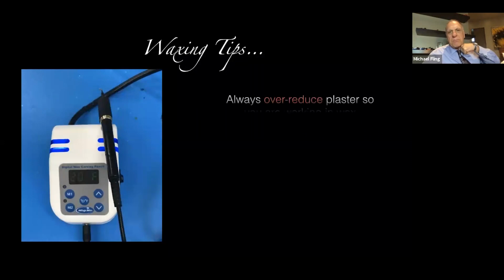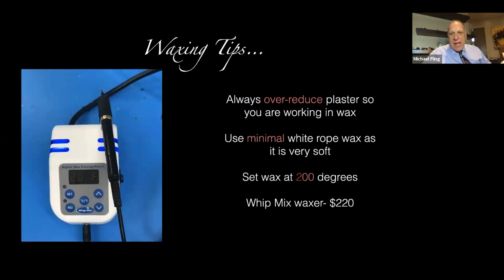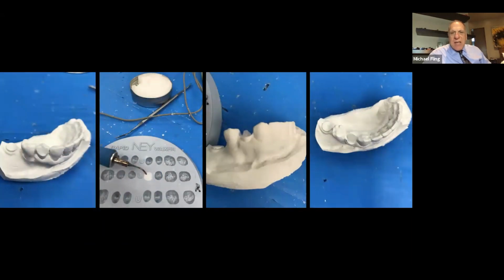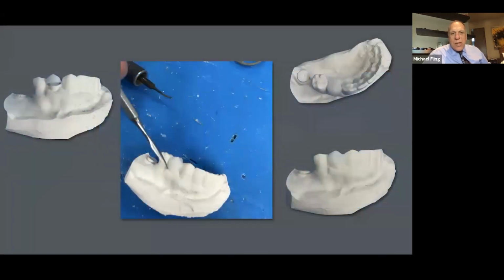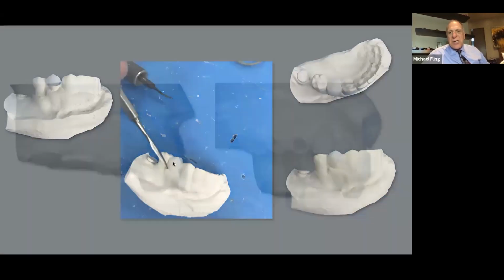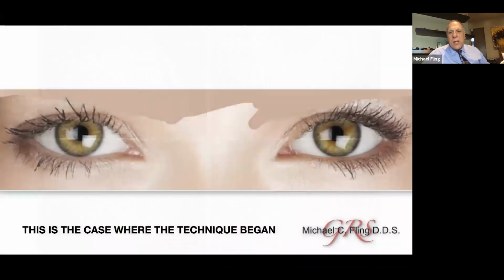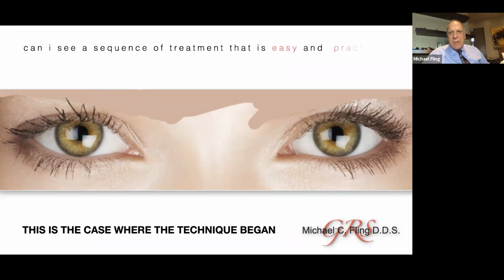Now then, I mentioned all of this about how to wax. Keep the plaster out of the way, because if you're waxing these teeth and you have plaster in the way, when it comes time to trim this, the plaster's hard, the wax isn't, and it really makes it difficult. So we really want to avoid the plaster if we can.